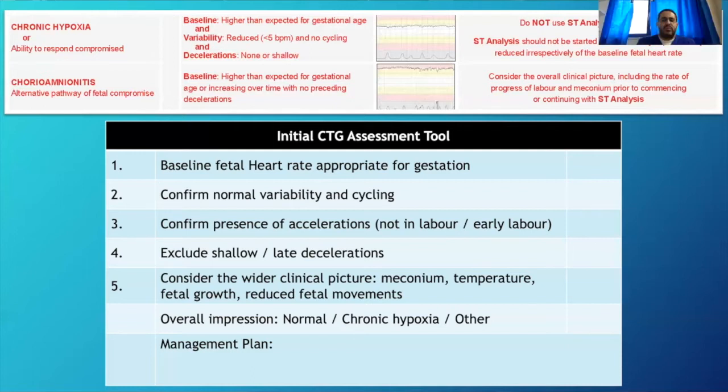Okay, we talked about that several times in the past: even if somebody's had a scan, please try and listen into the heartbeat to get the rate, because the scan is not going to tell you the heart rate. The scan is going to tell you that they've seen the heart beating. And that's a big missed opportunity. If there's nothing to compare to, unfortunately, you're stuck with the big population curves, which may be helpful, but not necessarily as specific and as sensitive as the actual baby's heart rate recording.